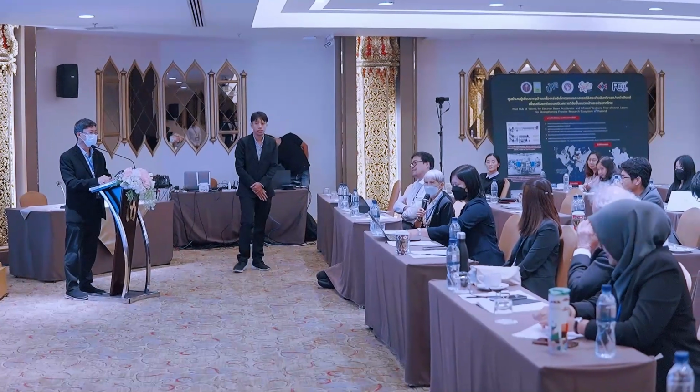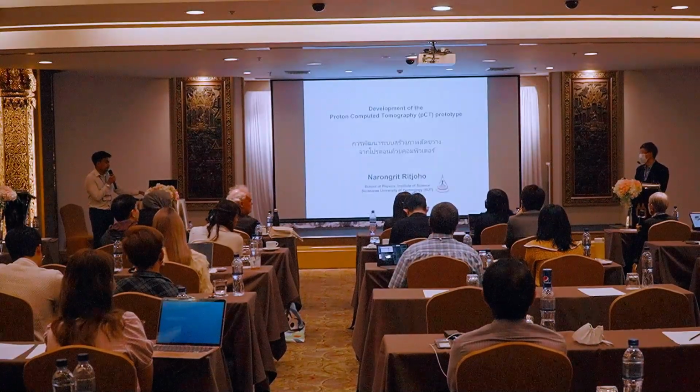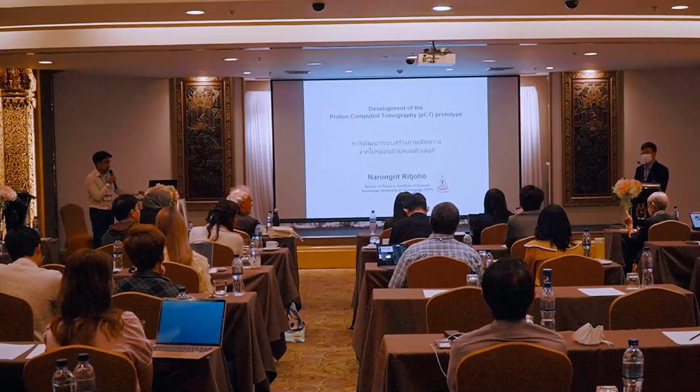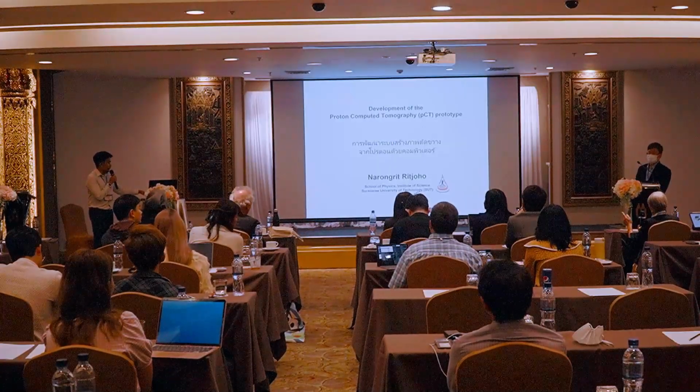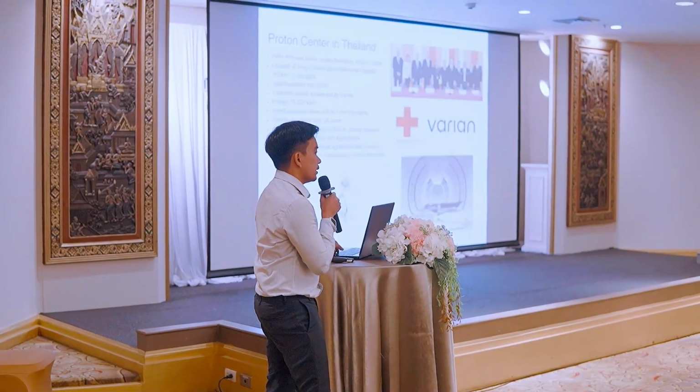I have a question about the range of protons. Now you have a phantom of how many centimeters thickness? This one is 5 centimeters only. So what is the target organ that you will have a proton? We just use acrylic now. This is the easiest one that we can produce.